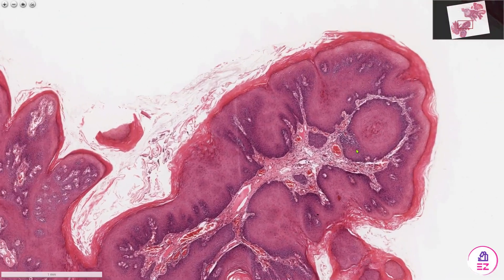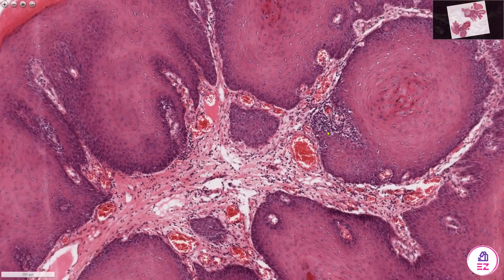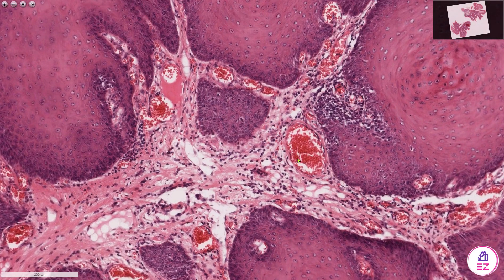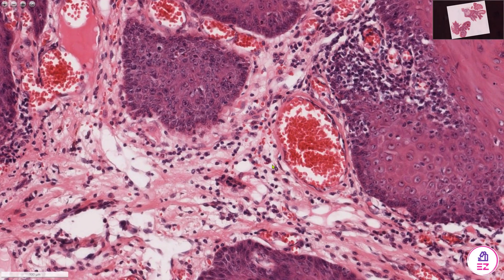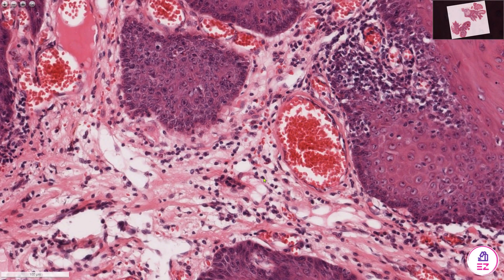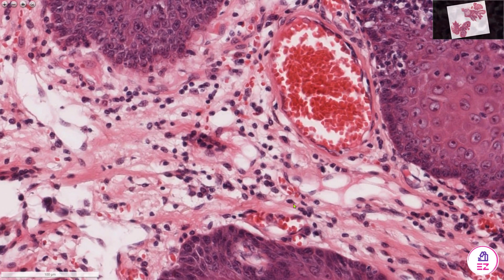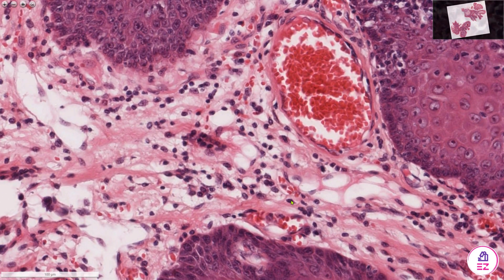It's not uncommon to see foci of inflammatory cells as well. In this case we have multiple lymphocytes and it looks like the occasional plasma cell as well.